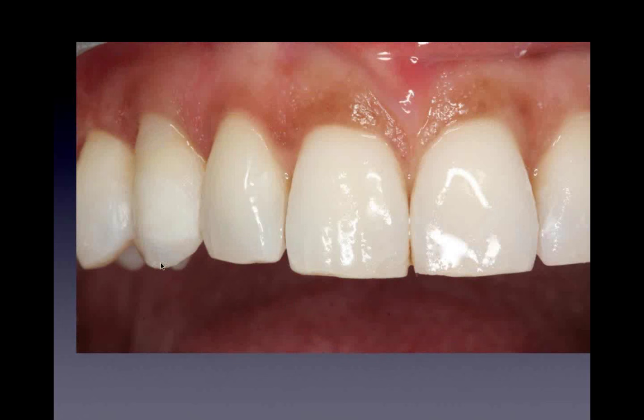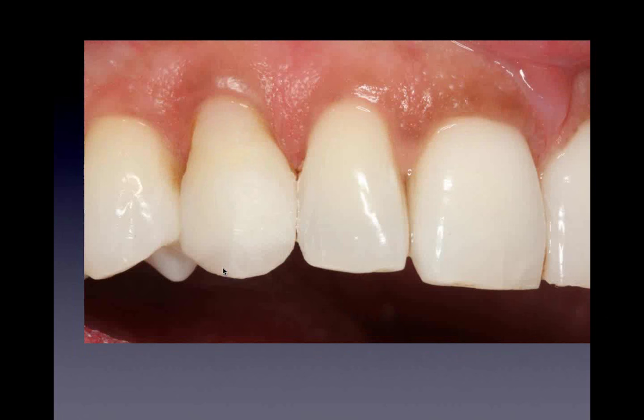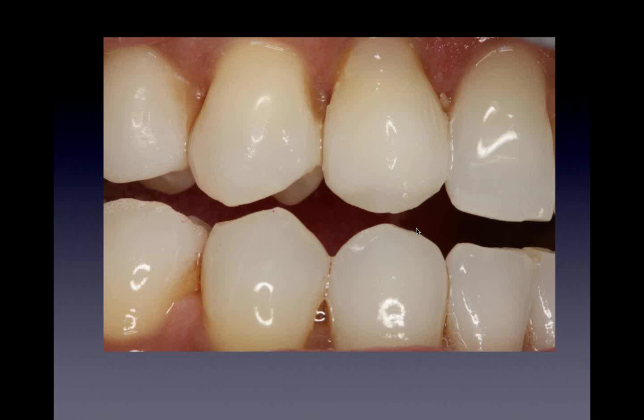So you see, this is where I really wind up with the function, and then I go into excursions with her. So here's my three layers right there. I'm not even polishing. I just want to get the occlusion down. Here's my occlusion in centric. This is starting to hit, so that's not good. I've got to get rid of that contour. So I recontour a little bit of the lower premolar, and then a little bit of the canine. This is her opening and closing.